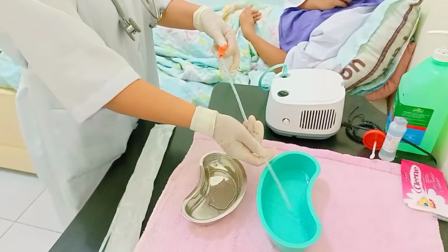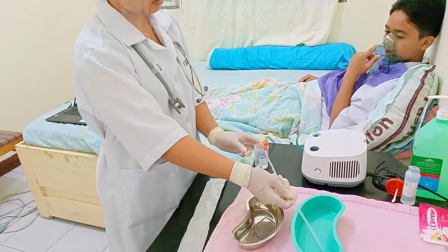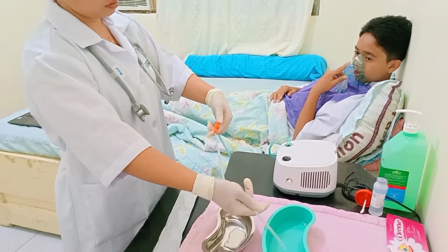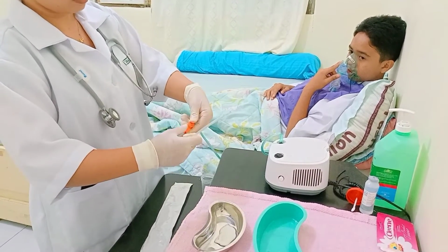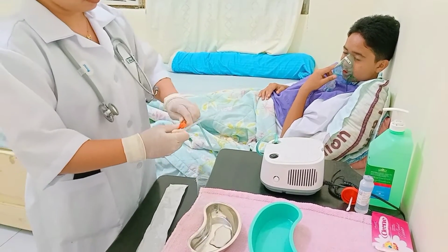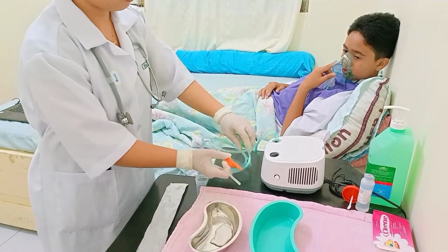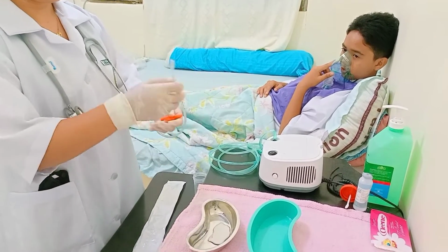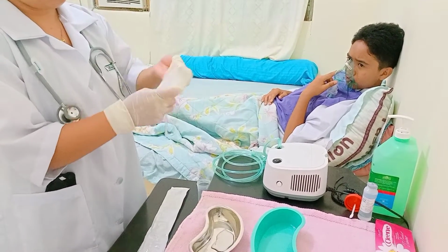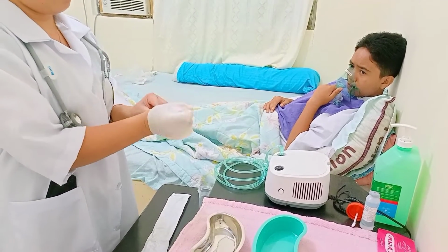Reconnect the suction catheter to the tubing. Flush the catheter to remove secretions from the tubing. Turn off the suction machine and dispose of the catheter, gloves, water, and waste container. Coil the suction catheter with your dominant hand. Pull the glove over the coiled catheter. Discard the glove containing the catheter in a biohazard receptacle designated by your agency.